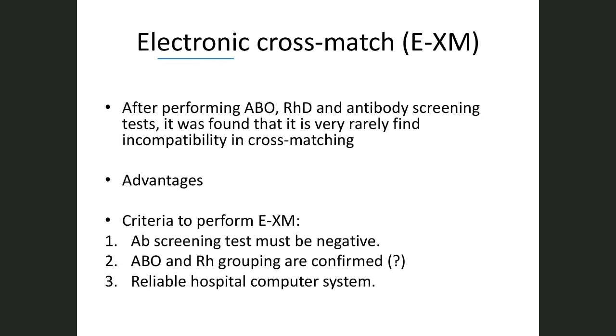So segment, plasma, cross them together. So it's just theory. For example, if the patient is B, the computer will select a unit and tell me to take the one with a certain number.